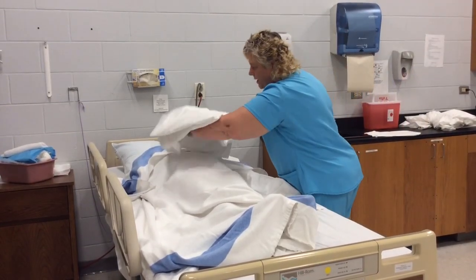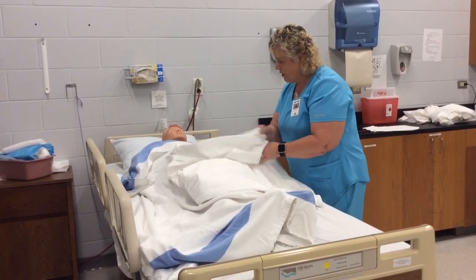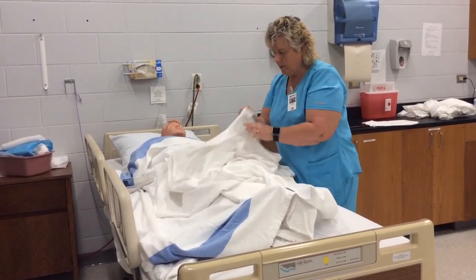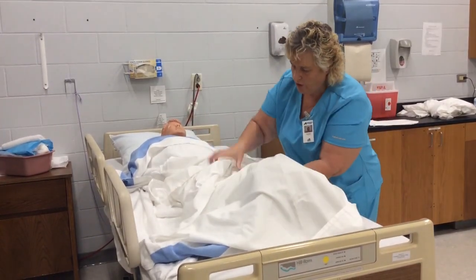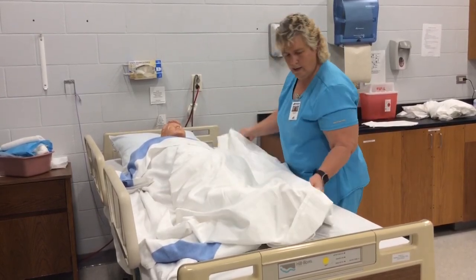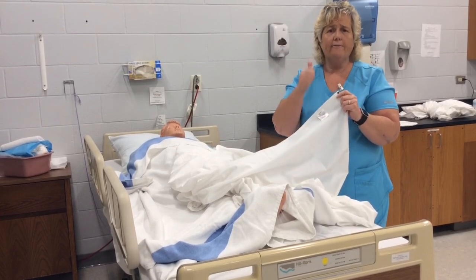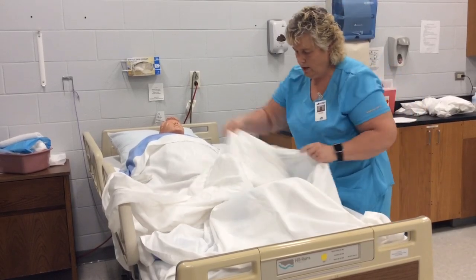Try not to let it touch you much. Don't let it touch the floor, and just take your time and start unfolding it, because what you're looking for is the seams. If there's a tag, and there is on this one, we're gonna make sure that it goes to the bottom, and then just start unfolding. I'm gonna show you on that seam where that tag is. That is a rough side, so I want that facing up. So you will see the tag on the outside.